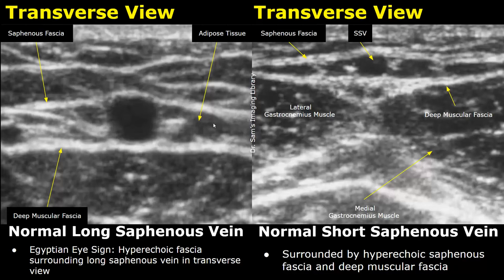This type of appearance is termed the Egyptian eye sign, where the hyperechoic fascia surrounds the long saphenous vein in transverse view. The short saphenous vein is also surrounded by hyperechoic fascia in a similar manner. Below the deep muscular fascia, we can also see the lateral and medial gastrocnemius muscles.